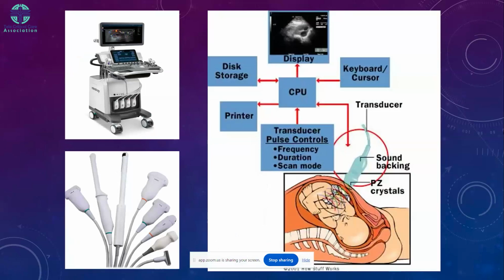So this is basically an ultrasonography machine, which consists of your screen, your basic array of buttons, which control all the functions, and your different probes.